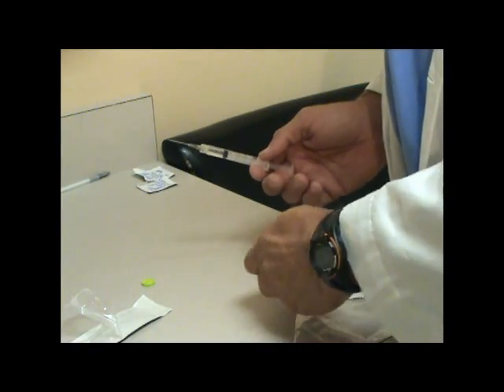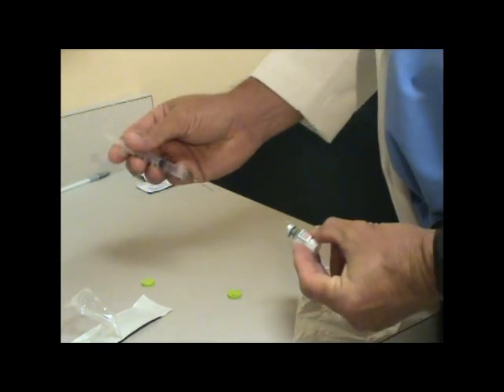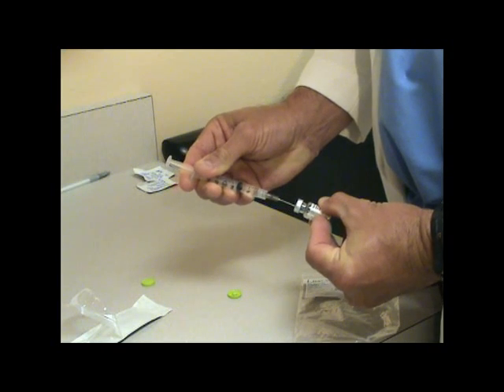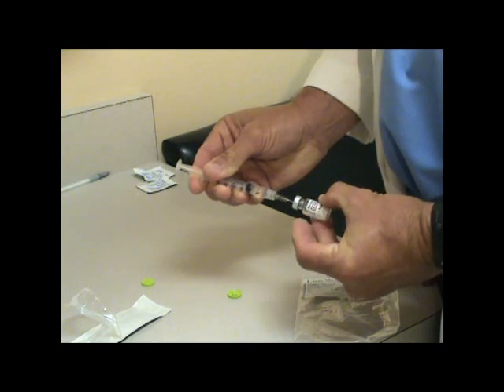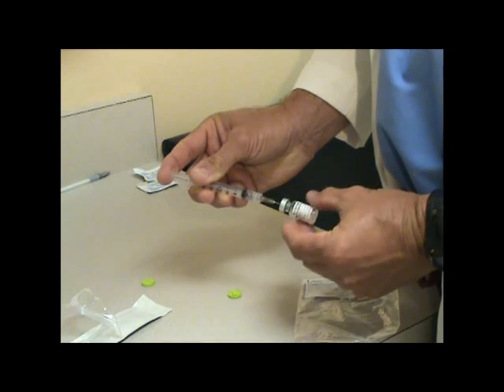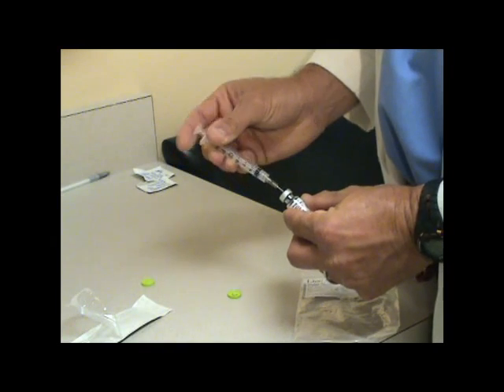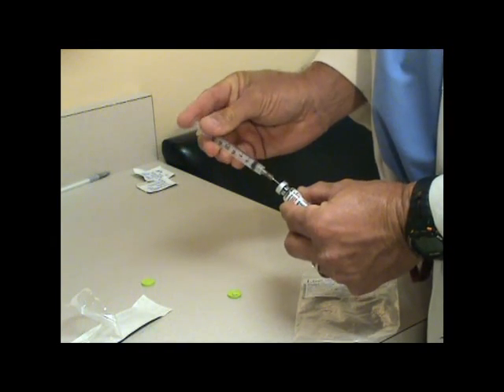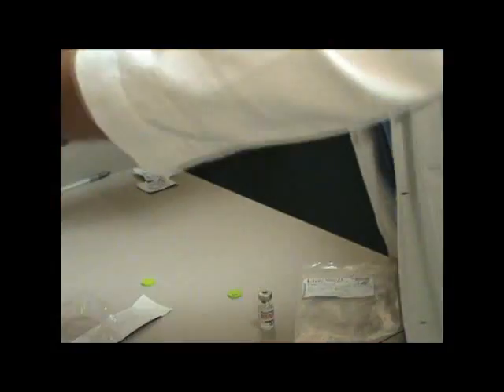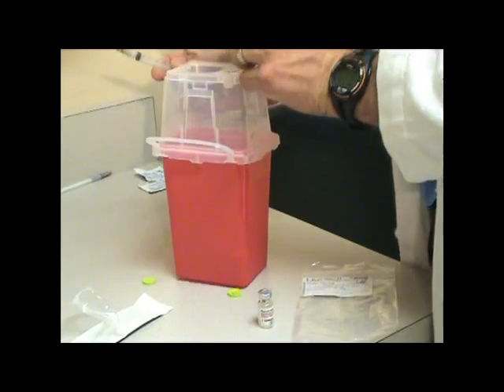Then you take the Omnitrope and inject that directly into it. As you're injecting, rotate this slowly. It's only about 1.14cc's, so it's not a whole lot of fluid. When you're done with that, take the needle and put it in your sharps box — preferably without capping it.